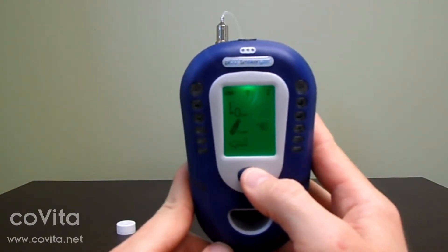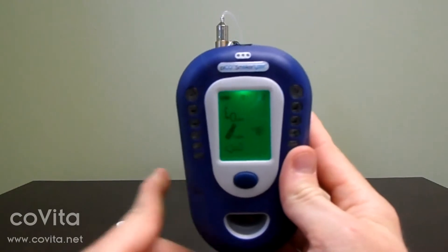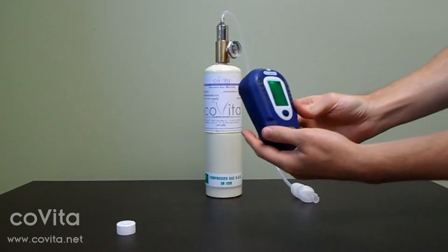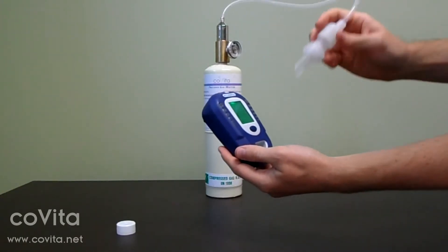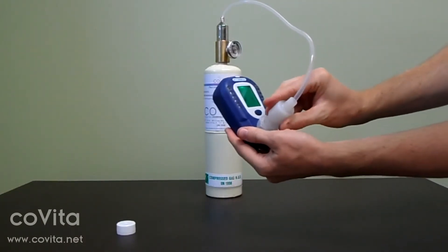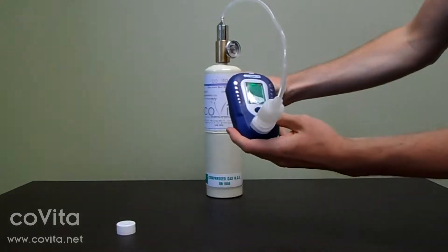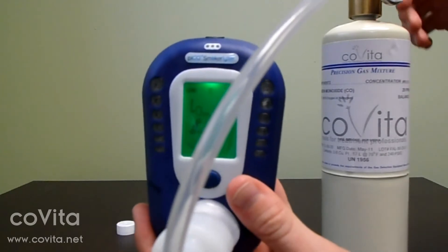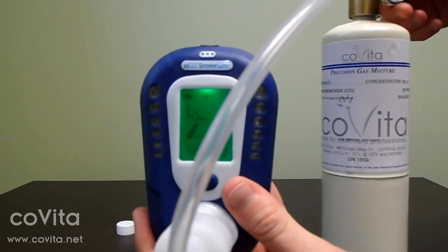Single-click to scroll down to the can of gas. Connect the D piece to the monitor. Double-click to select the gas icon and begin calibration.